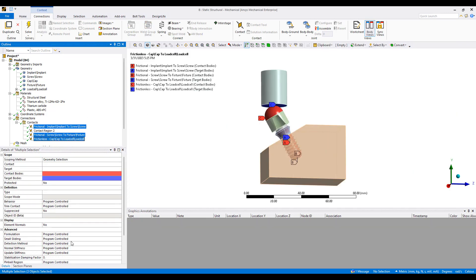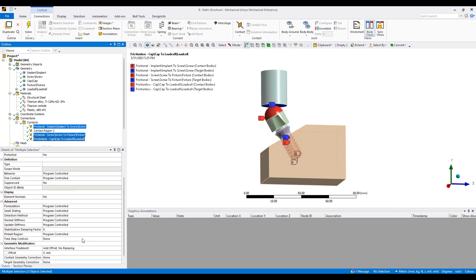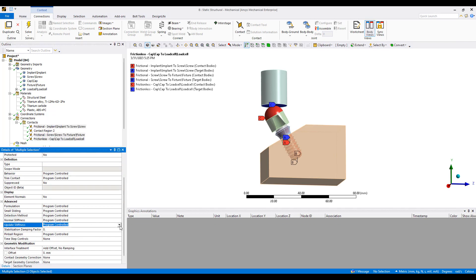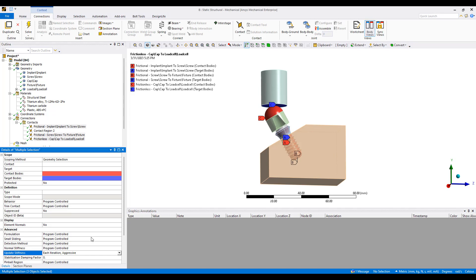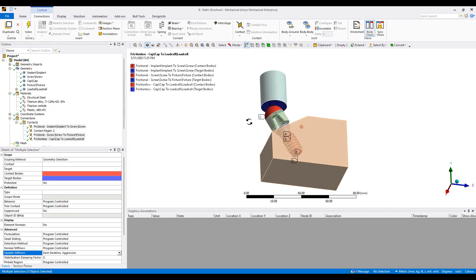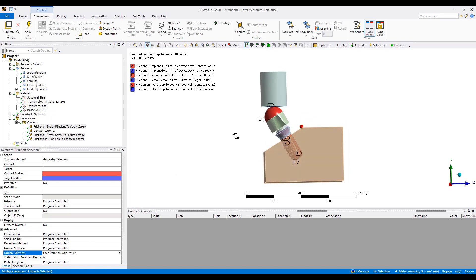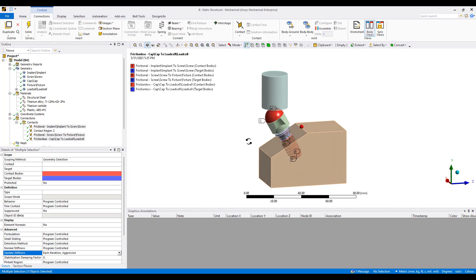Those are the contacts that needed to be set up. I'll set a frictional coefficient of one but this depends on your test data and how much friction you think is at those interfaces. These are nonlinear contacts. One quick way of making sure we have a fast and stable solution is to update the stiffness at each iteration so ANSYS can adjust the stiffness to ensure better convergence.